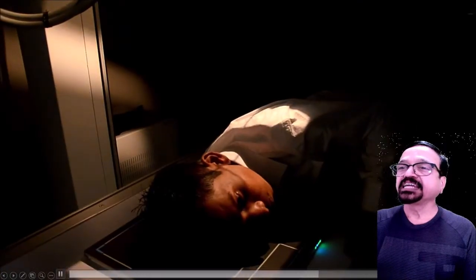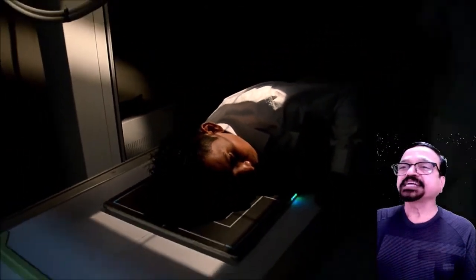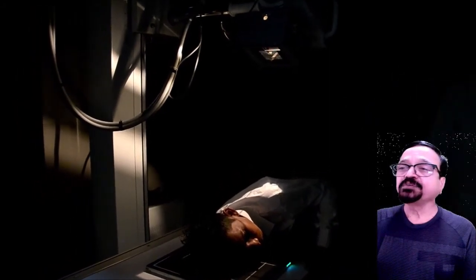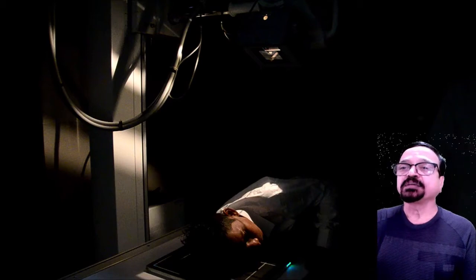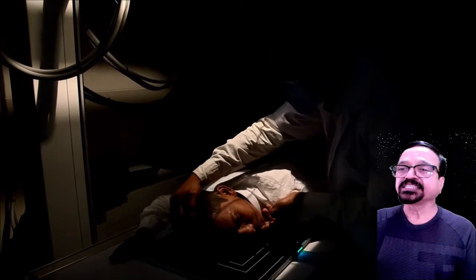Now the light is put off just to see the collimator light. The collimator light gives us a fair idea. The light we are seeing from the cassette is because it's a DR cassette. Now this is the way the patient is positioned, and then we can take the exposure. For this X-ray we do not need to put off the light or need any darkness. Darkness is given or shown just to see that collimation is done properly. So once you collimate properly, yes, then we can go for an X-ray. A good quality X-ray will come.